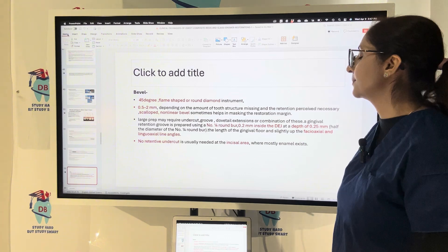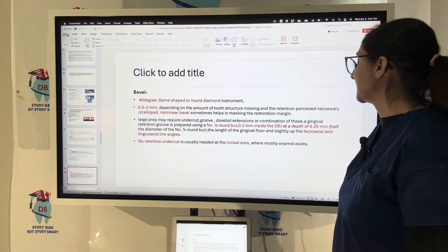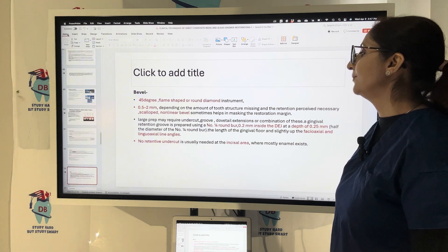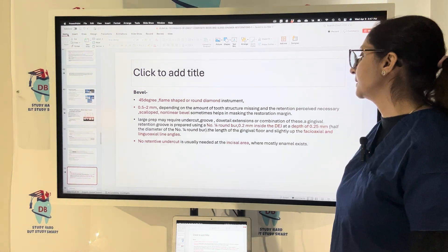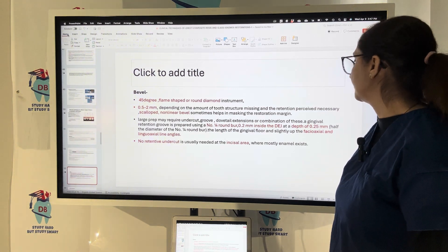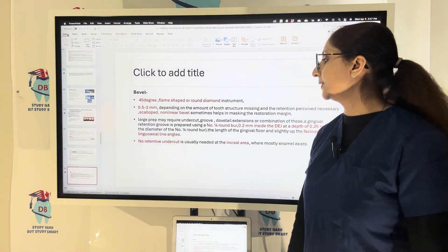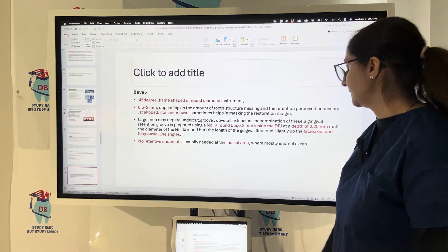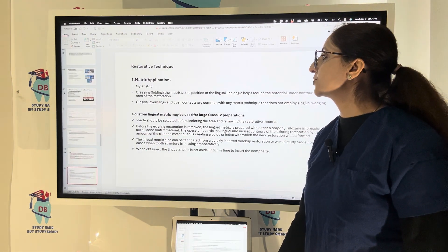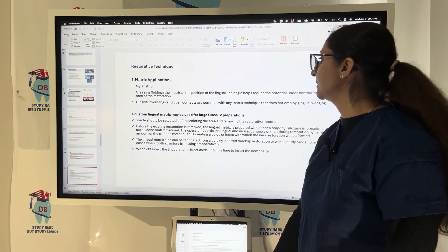A gingival retention groove is prepared using a number 1/4 round bur, 0.2 mm inside the DEJ at a depth of 0.25 mm (half the diameter of the number 1/4 round bur), with the length of the gingival floor extending slightly up the facial-axial and lingual-axial line angles. No retentive undercut is usually needed at the incisal area. The mylar strip matrix is applied, and the position of the lingual line angle helps reduce potential under-contouring.